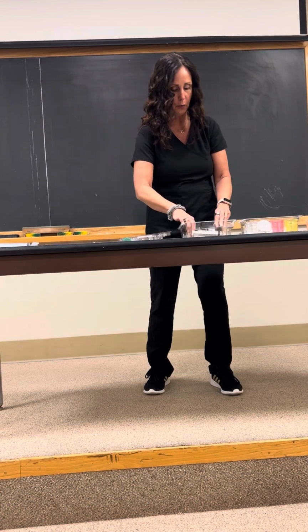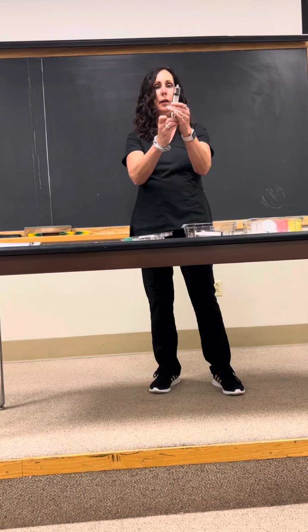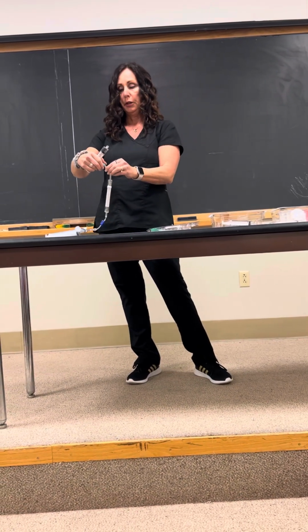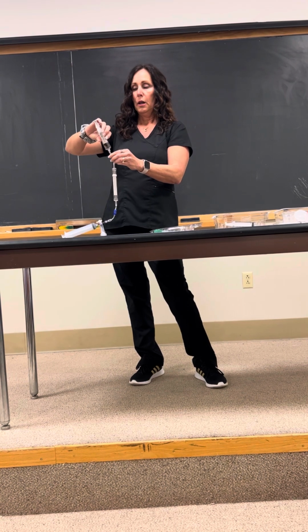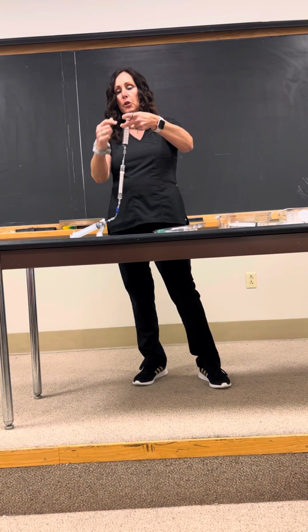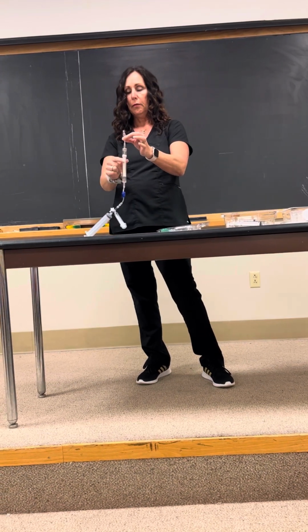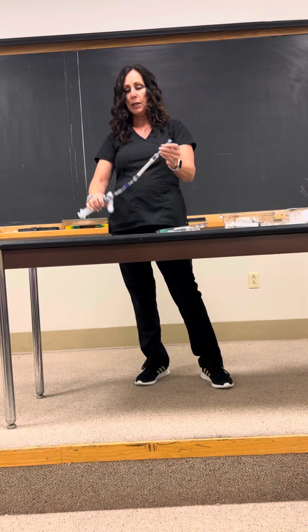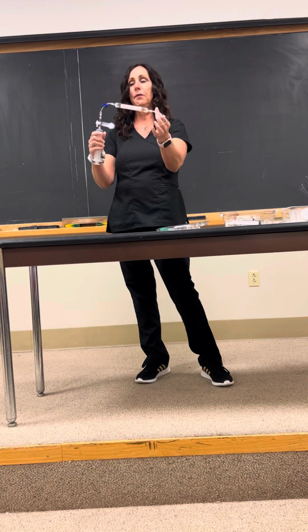You're going to now do the same thing with your second syringe and, again, flush really well with heparin. And with the rest of this heparin, I'm going to flush my filter. Again, everything that is going to come into contact with marrow, we want to flush with heparin. My clamp is closed, so it's going to give me some pressure here. I'm going to hold down my plunger while I disconnect, and it's going to give you a little pop. But I want the heparin to stay in that filter for a short time. I'm going to put my cap back on, and I rock that filter back and forth just to make sure that the heparin gets really well coated on the inside of that filter.